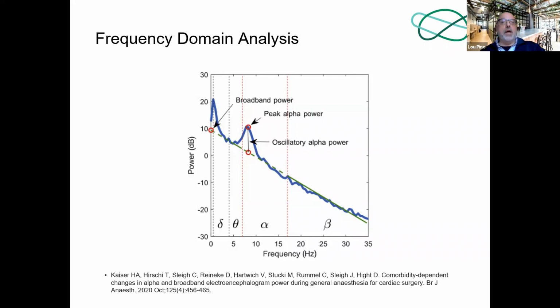When a person closes their eyes, there is no external stimuli arriving at the occipital. So when this region goes quiet, it starts to oscillate at the alpha frequency. Often the alpha waves are so strong that they can be seen by the naked eye just by looking at the raw data. The alpha wave also is common for other sensory processing areas of the brain when those areas go quiet. So when we see strong alpha oscillations in a brain region, it usually indicates that the brain region is quiet.